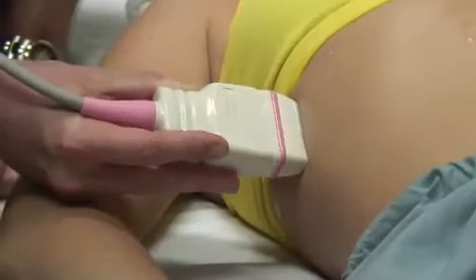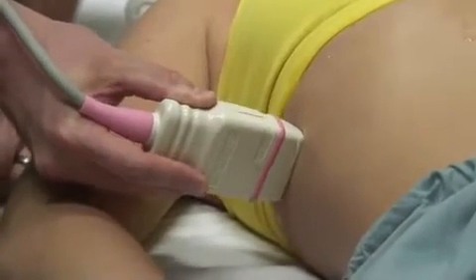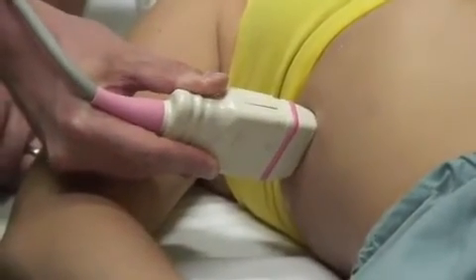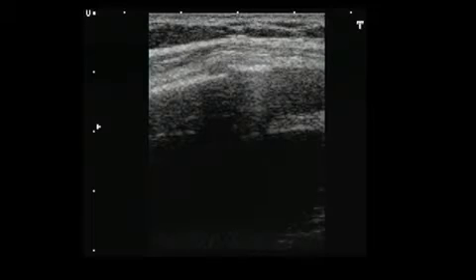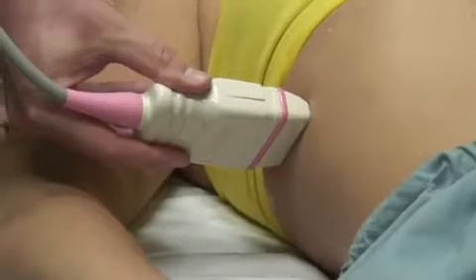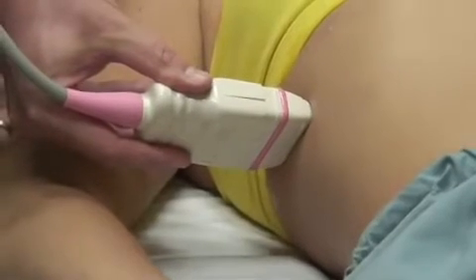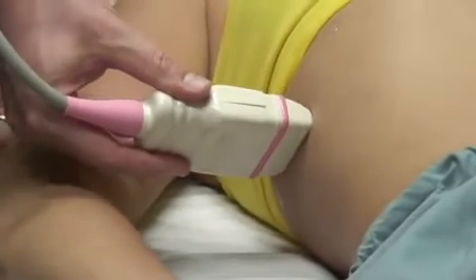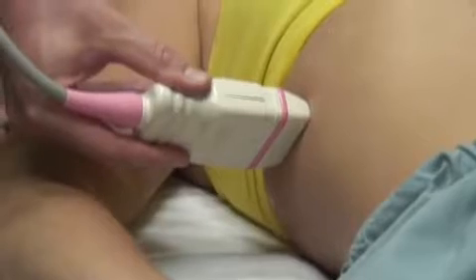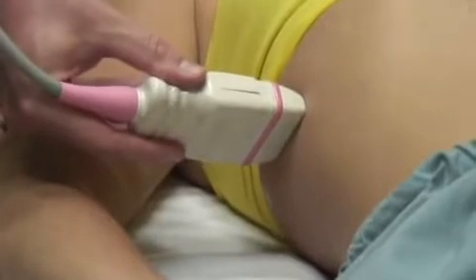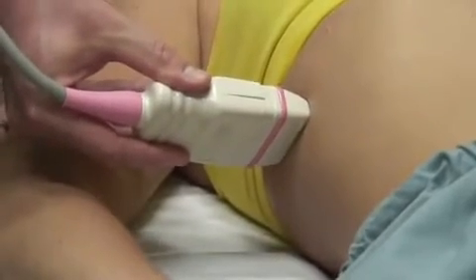By turning the probe 90 degrees, a longitudinal view of the rib can be obtained, confirming the fracture, which in this case is the displaced portion of the proximal cortex. Slight pressure with the probe will palpate the precise area of the visualized fracture, further confirming that point as the area of maximal tenderness.